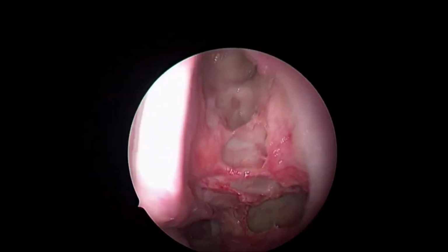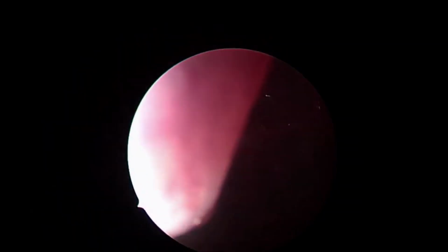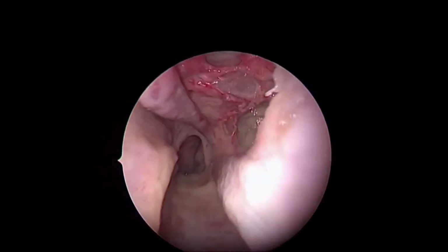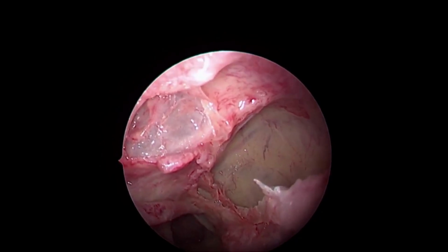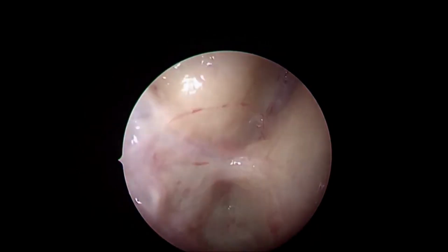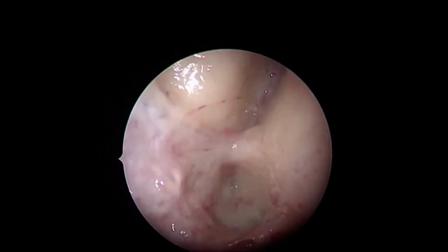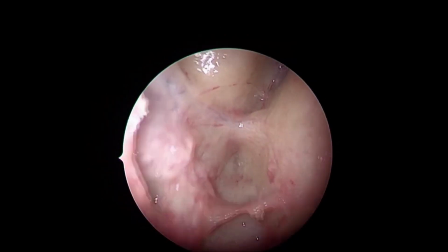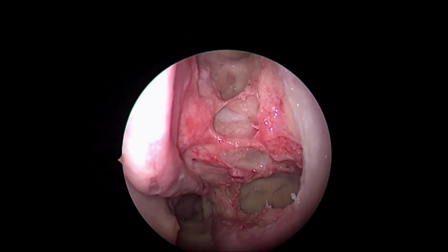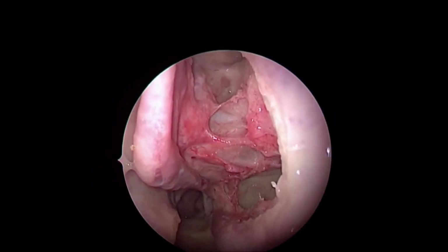Now, coming to this, all this is about the anterior group of sinuses. For those who have joined late, we first did endoscopic anatomy, then middle meatal antrostomy after uncinectomy, then we went up with the 70-degree to do the frontal sinus work and the anterior ethmoidal skull base work. You can see the anterior ethmoidal artery there with 0 degree now. We'll see the anatomy and the implications. Why are surgeons so terrified of this vessel? What is the implication of injuring it? We discussed this during our complication talk as well, but this is the time in cadaver to discuss certain issues.